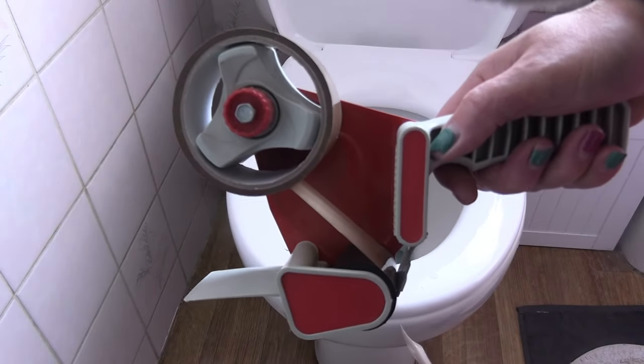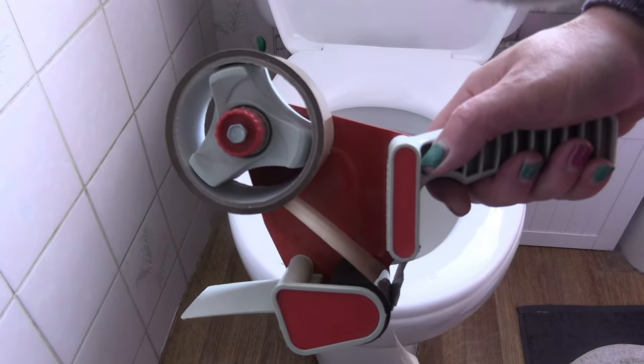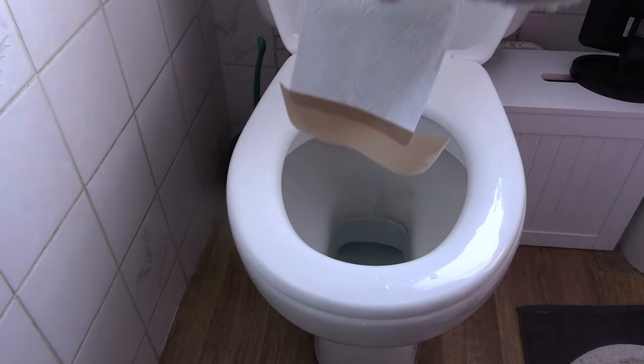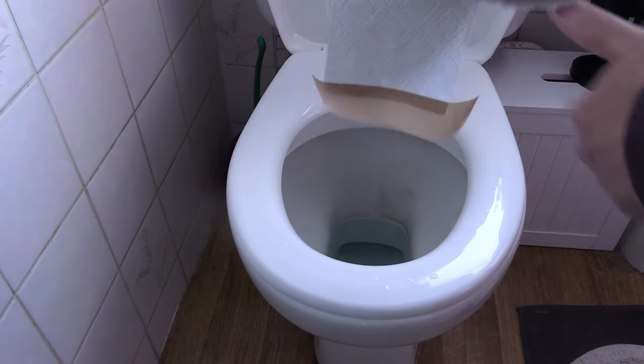I'm using brown sticky tape so you can see what I'm going to do with it, but ordinarily use sellotape. All I've done is put the tape on the end of the roll.